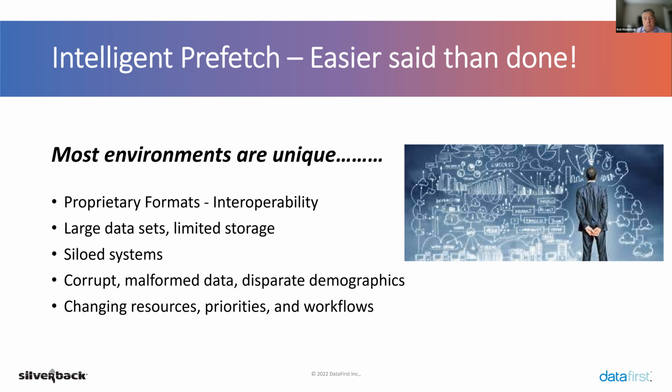So, I think one of the important features inside any prefetch engine is the ability to update demographic data using inbound crosswalks with the new patient ID, so that you're moving those studies and allowing those to be commonly viewed, even though they may be coming from 5, 6, 7 different source systems.